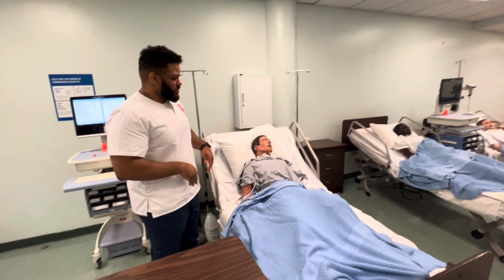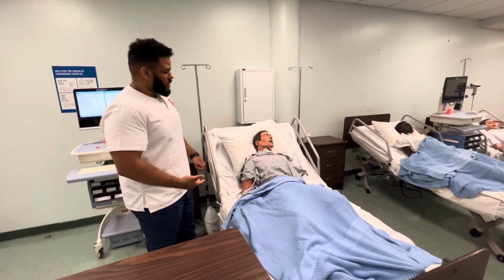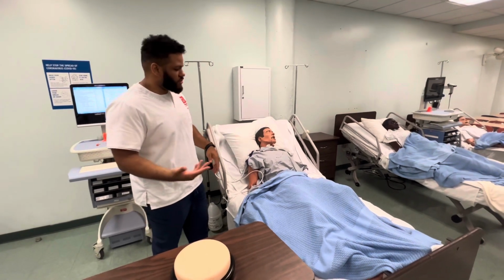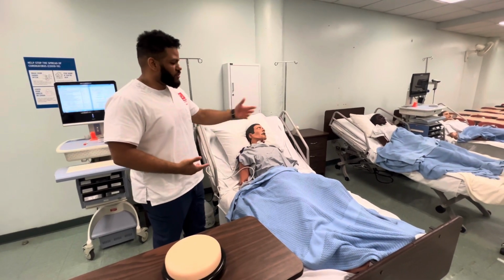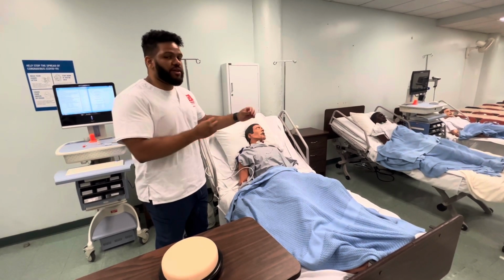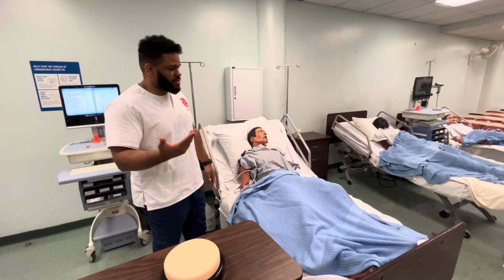So another thing is you want to make sure you let the patient know what it is exactly you're going to do. We're giving insulin, so I'll let them know some of the implications about that and go over some of the education. So I'll say something like, oh, I noticed you have food here. This is perfect. It's really important that we have food readily available when we're giving regular insulin, because if not, we can risk a hypoglycemic effect.